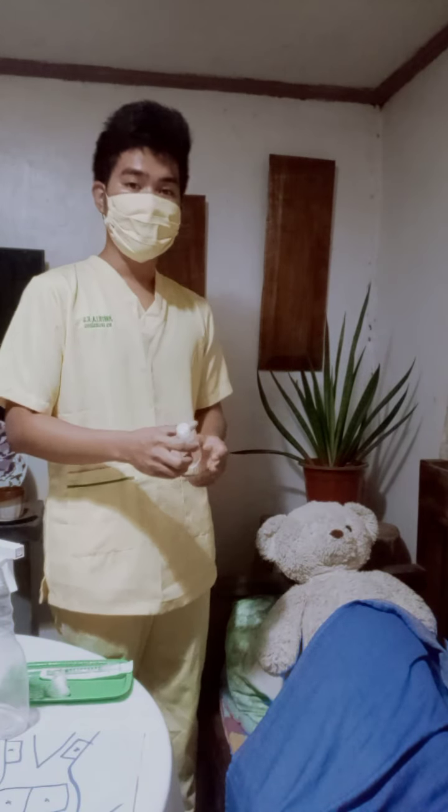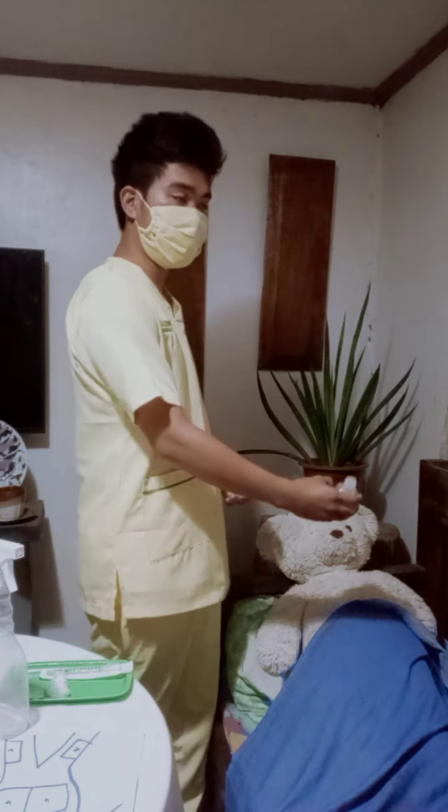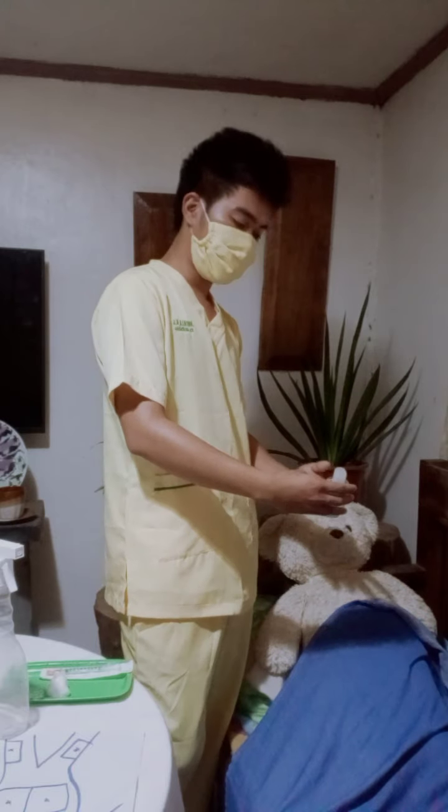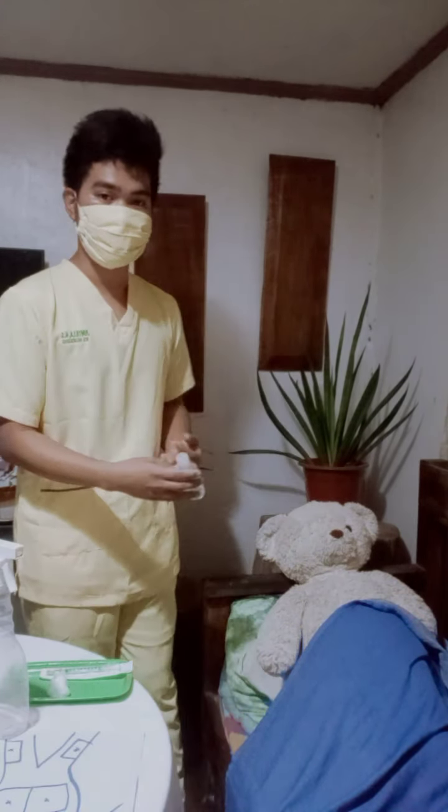Better that he or she knows what the labels are, for example the expiration date. So we're going to give it to our patient and discuss what the labels of the vial are. That's it. It's very important.